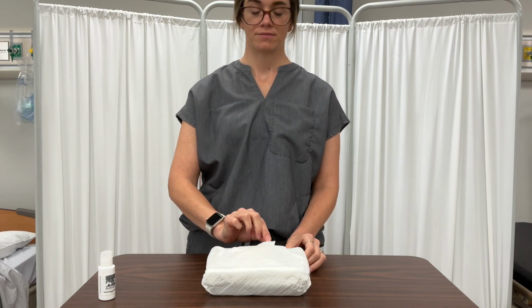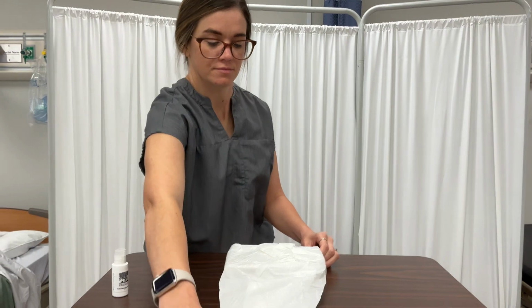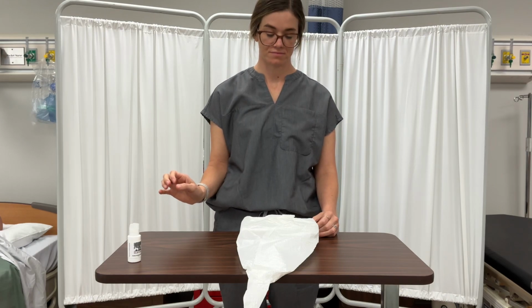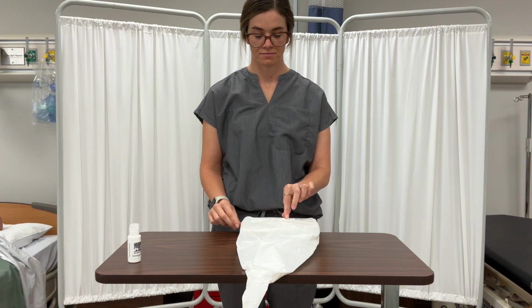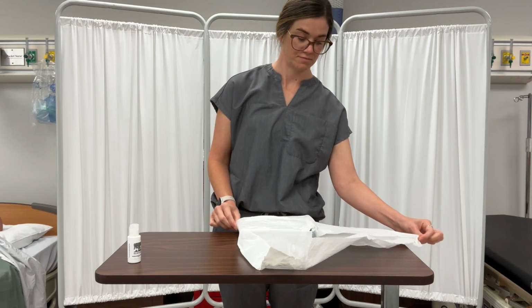Okay. So she's going to grasp the outer surface of the edge on the first flap and open it by pulling to the side and allowing it to lie flat on the surface. So you can kind of see that. And she's going to repeat this process with the second side flap.